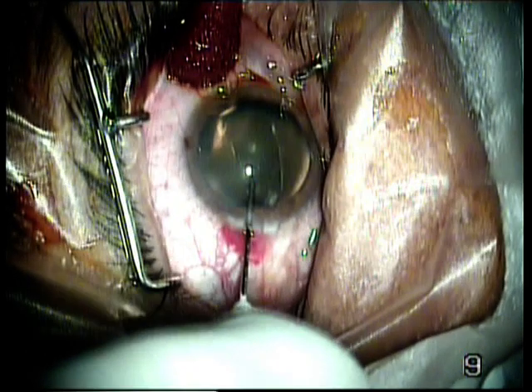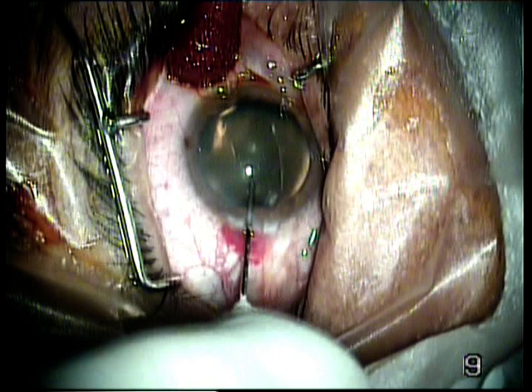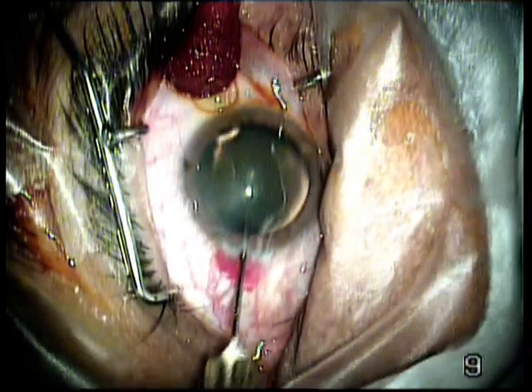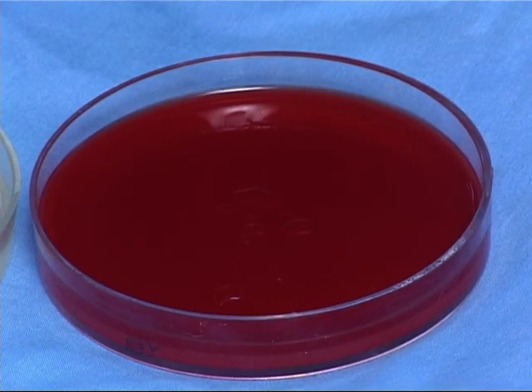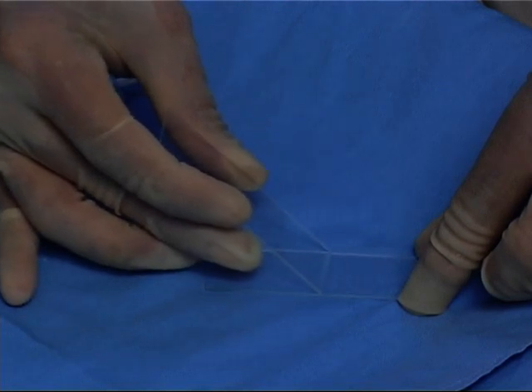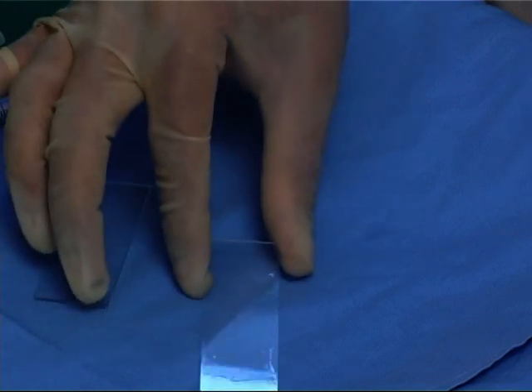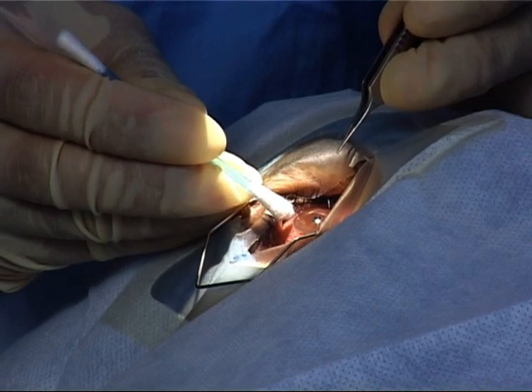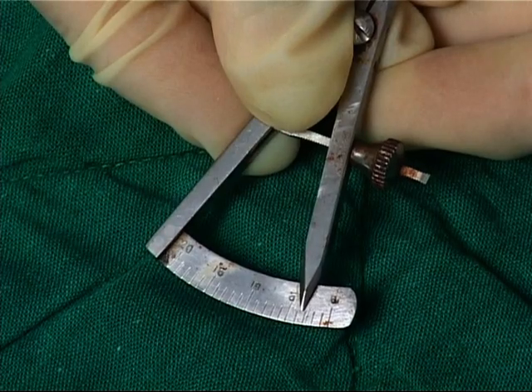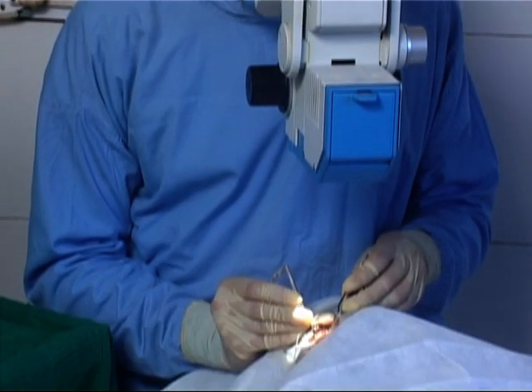Once the tip of the needle is visible inside the anterior chamber, withdraw 0.1 ml of aqueous into the syringe. Put one drop on two different slides and inoculate the rest onto an agar plate for incubation. This withdrawal provides a sample for testing and decreases IOP for further injections. Ensure there is no leak at the site of entry using a cotton bud.